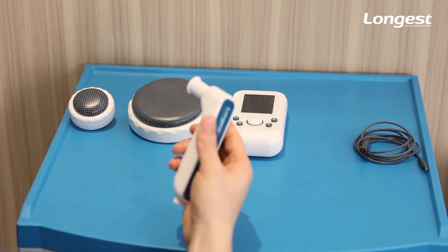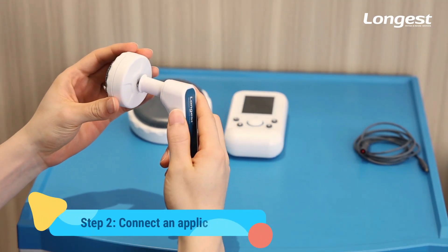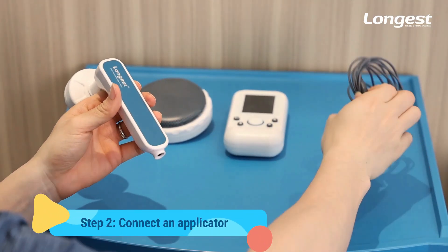There are two sizes of oscillating heads. Choose the appropriate size according to the treatment area, then connect the applicator with the device.